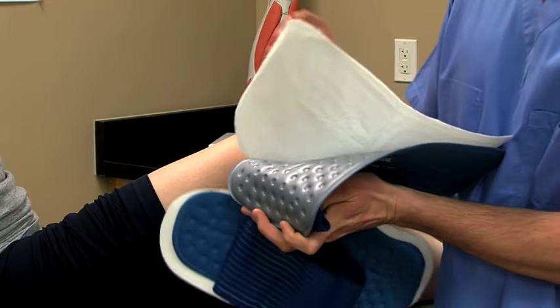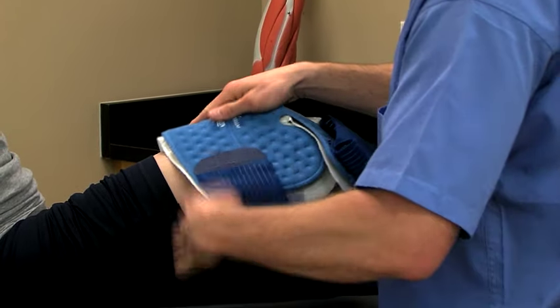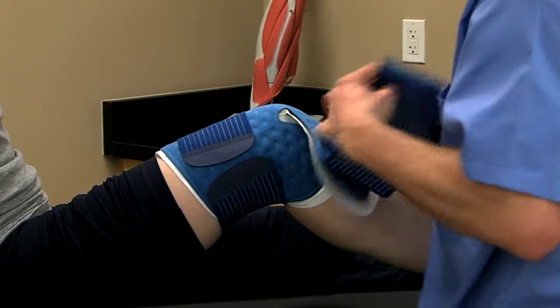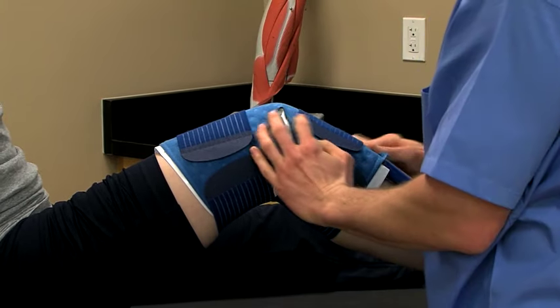With the insulation barrier in place, apply the pad to the patient with the blue side up. Then use elastic straps to hold the pad in place. For information on how to properly apply a specific pad, watch the pad module that details your specific pad.